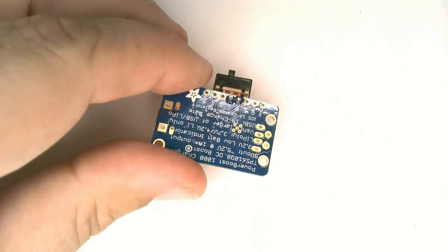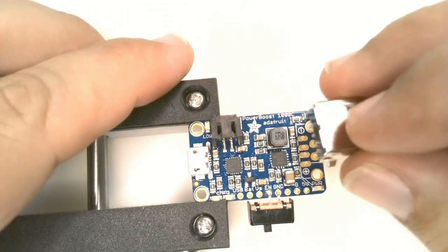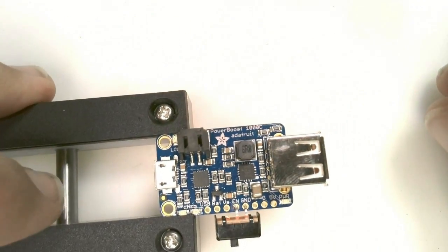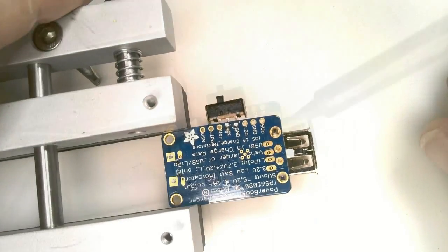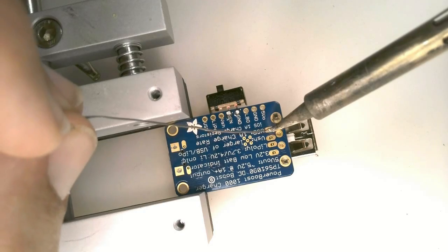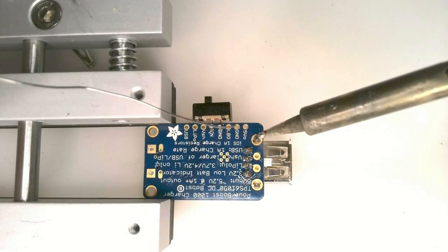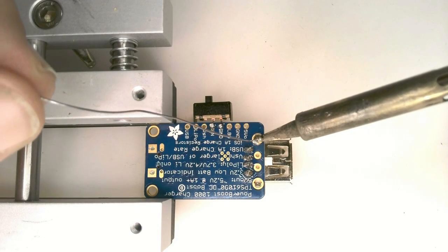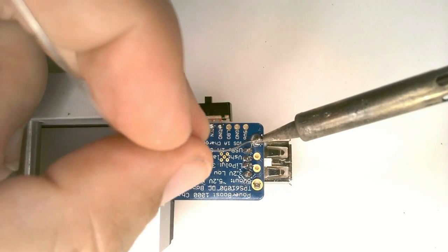Next, we will insert the large USB-A connector into the component side of the board. Flip it over and solder it in place. There are 4 small electrical connections that you should solder first, and then 2 large mounting pins. These pins will take a lot of solder to fill the hole. Be careful, the component will be very hot afterwards.